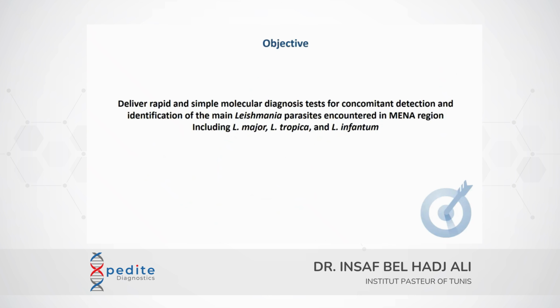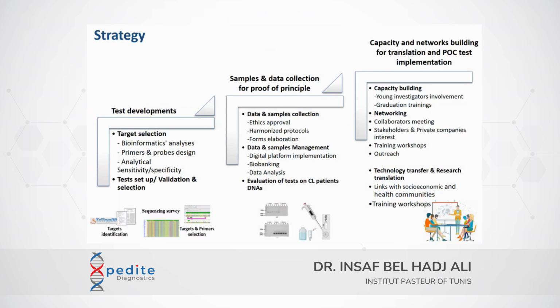So we use these technologies to deliver rapid and simple molecular diagnostic tests for concomitant detection and identification of the main Leishmania parasites encountered in MENA, including Leishmania major, Leishmania tropica, and Leishmania infantum. So to deliver such tests, we adopted this strategy.